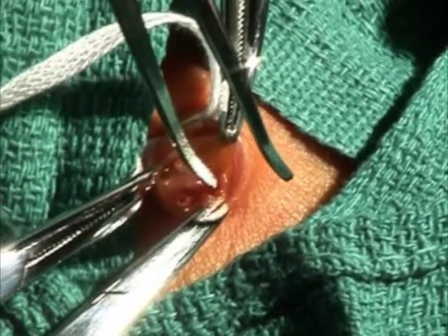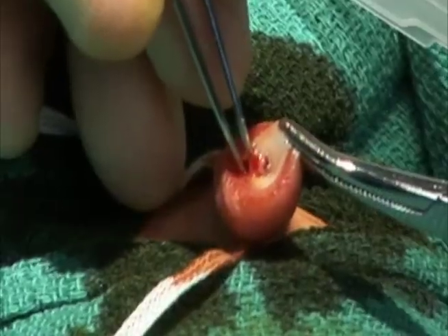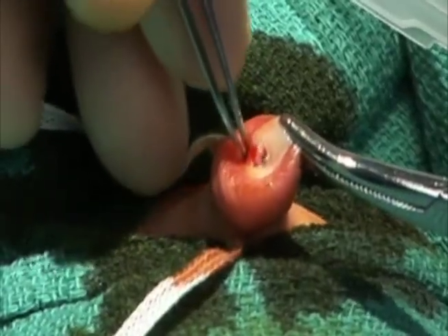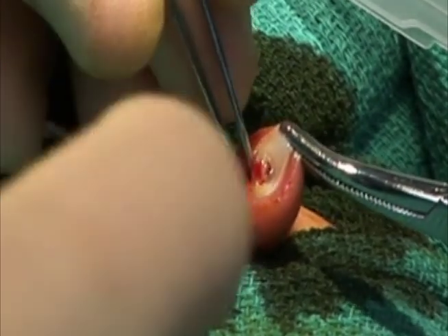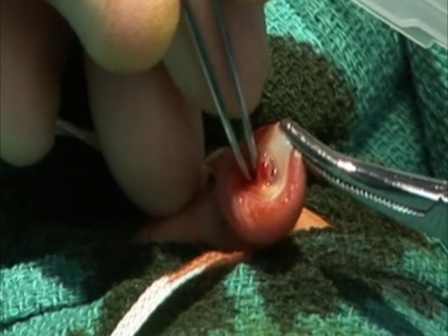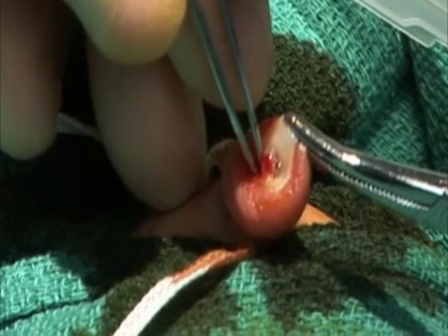Keep the tip closed on initial insertion and then remove the forceps. To dilate the artery further, place the closed tip of the forceps back into the artery, insert to a depth of 1 centimeter, and allow the forceps to open slowly. Leave the forceps in an open position for 20 seconds to dilate the vessel completely.